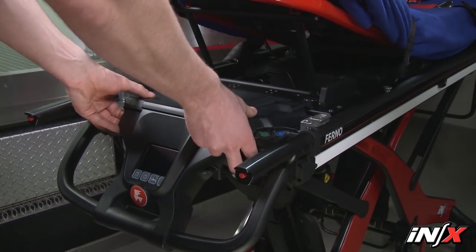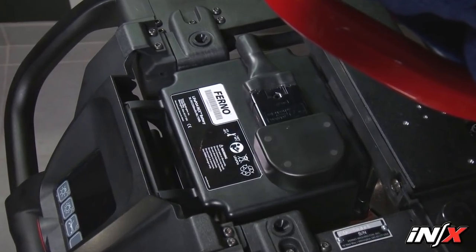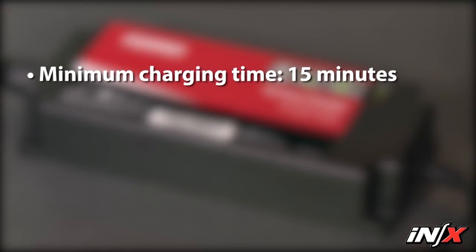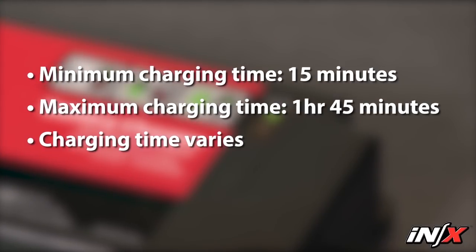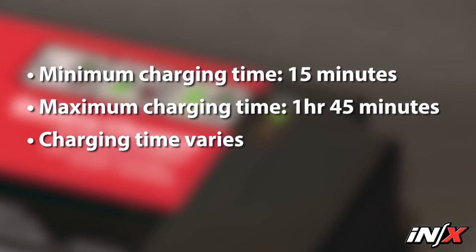The NX is powered by a rechargeable 36-volt DC lithium iron phosphate battery installed under the patient surface behind the display. It has no memory, and you don't have to fully discharge it before recharging. Minimum charging time is 15 minutes after one transport, maintaining the charge using an ICS. Maximum charging time is 1 hour and 45 minutes using the AC battery charger with a depleted battery. Minimum charging time varies based on frequency of recharge, depth of discharge, and battery age. If a battery becomes deeply discharged, extend the charging time. Patient weight and temperature affect the amount of use available from each battery charge.